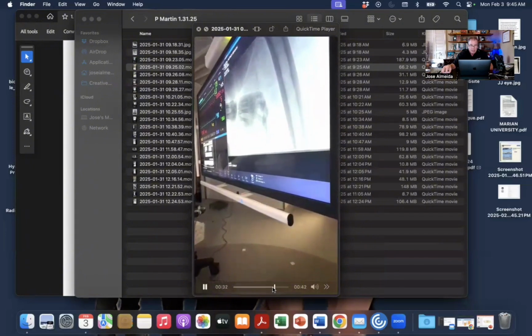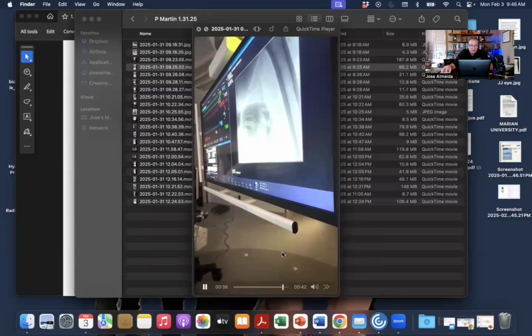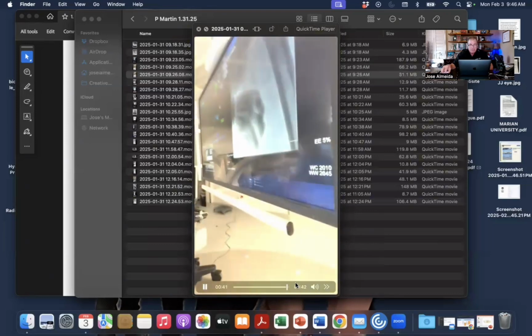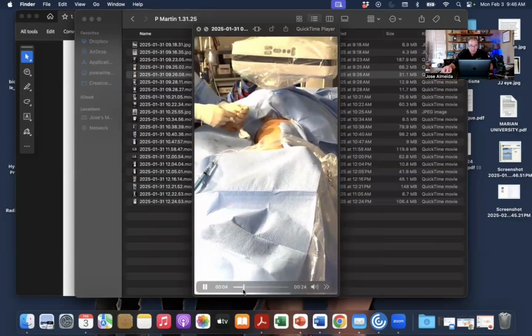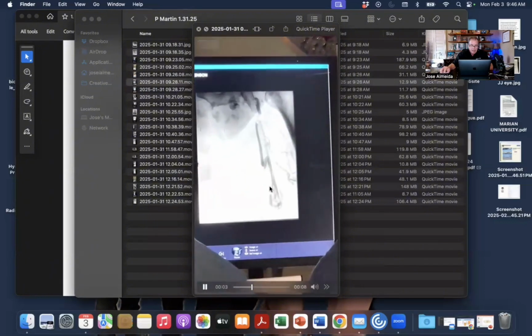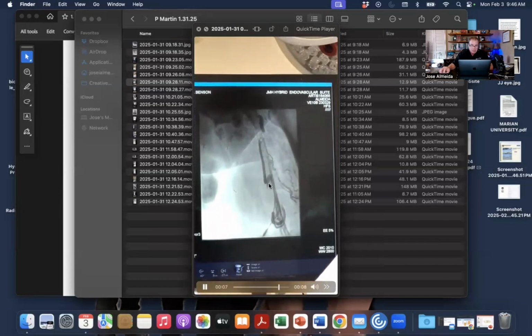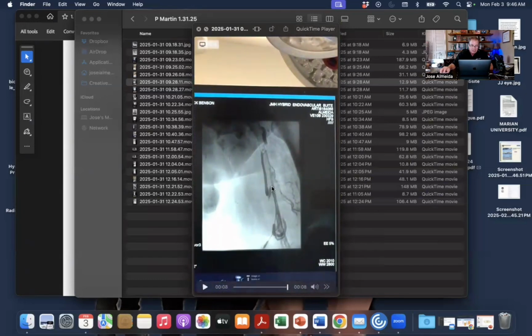There I am radiating my hand and navigating the wire up. So we did get some channel at around the mid-thigh of the femoral vein. Go ahead and upsize to a micro sheath and do a venogram. So here's where our access is, and I don't have much room to exchange for a bigger catheter to do a more aggressive recan from here.